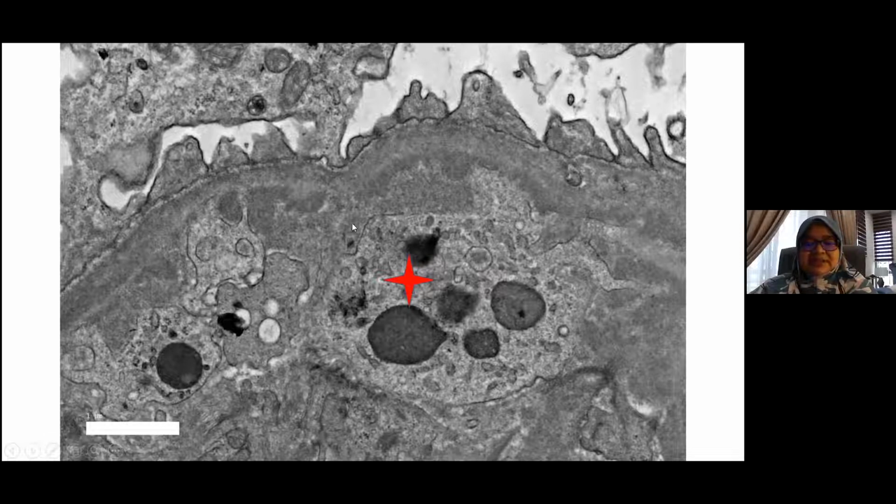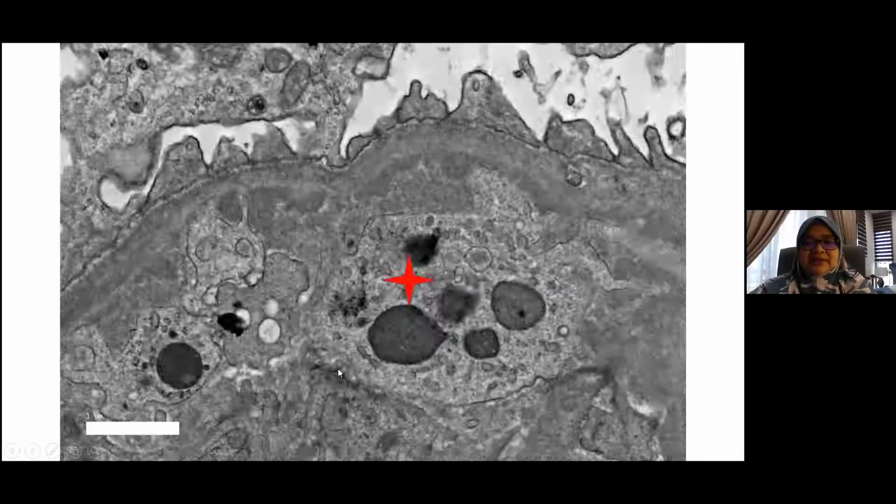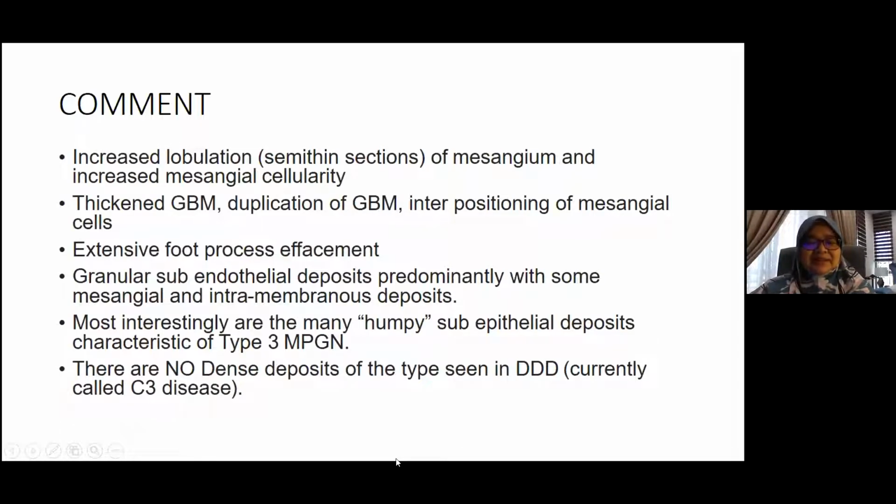So this is again part of the cytoplasmic process of the mesangial interpositioning. Okay, so higher power view of the subendothelial deposition and the foot process effacement. Okay, so I think you've seen enough of the images.